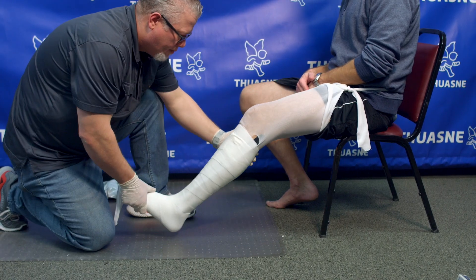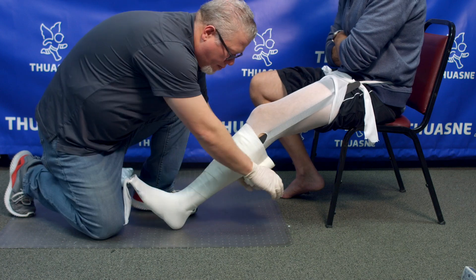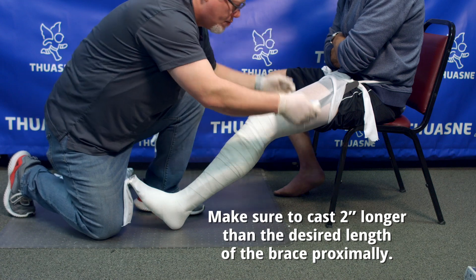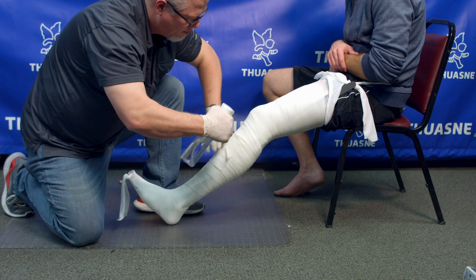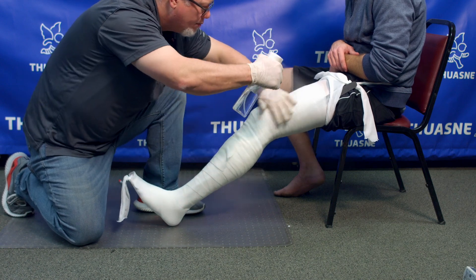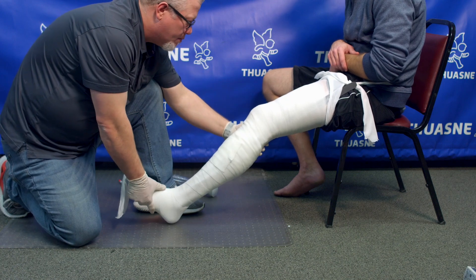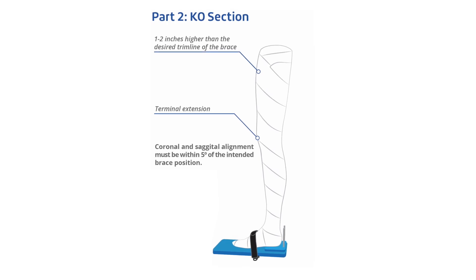Adjust the patient position to terminal extension. Place the cut strip. Start casting the patient with fiberglass. Make sure to make the cast 2 inches longer than the desired length of the brace. Once you have finished applying the fiberglass, start generously spraying the entire surface of the cast with a water spray bottle. Place the patient in the correct position: terminal extension, neutral sagittal and coronal alignment.